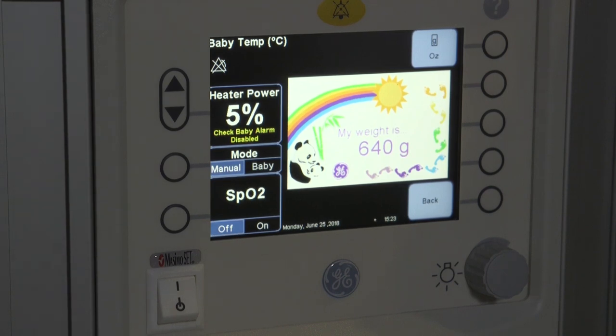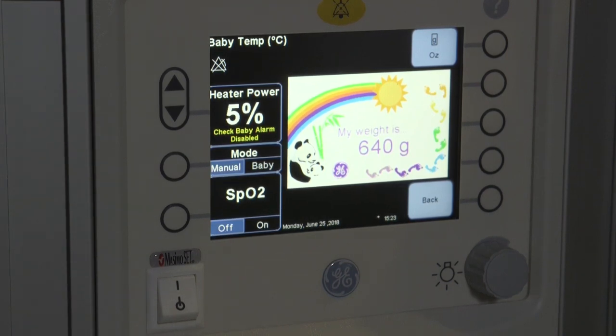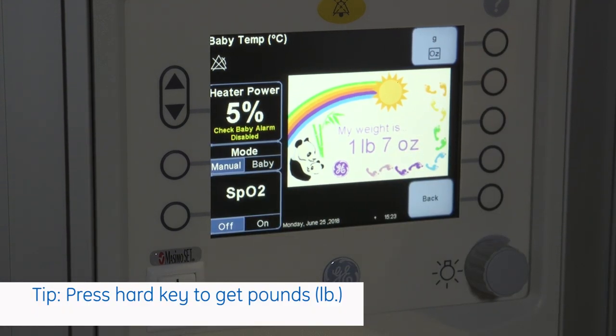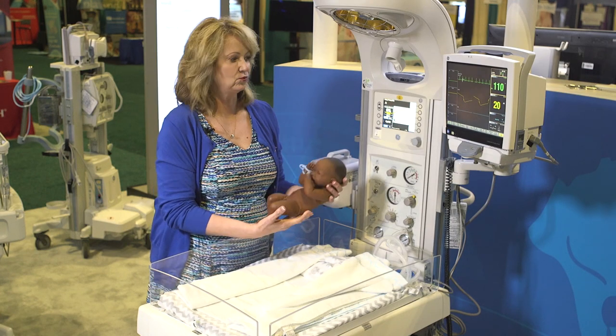Now you can see my baby weighs 640 grams. Parents will want to see a pounds and ounces type of weight as well. It's also a great little time for a photo op.